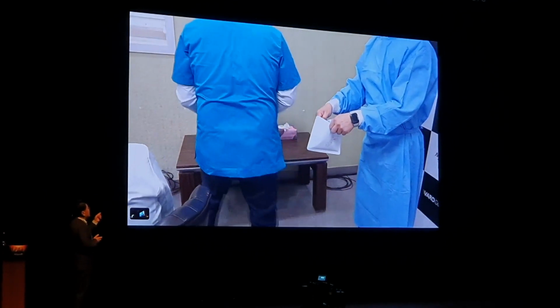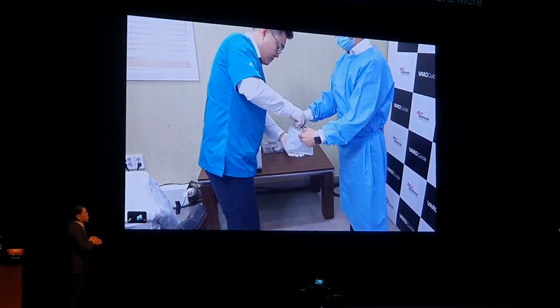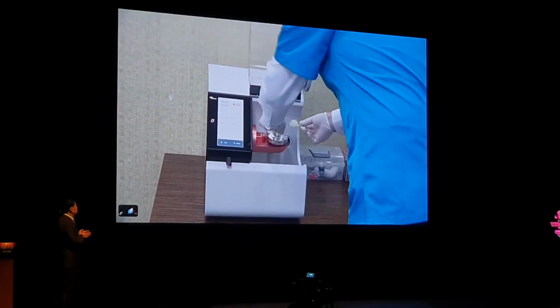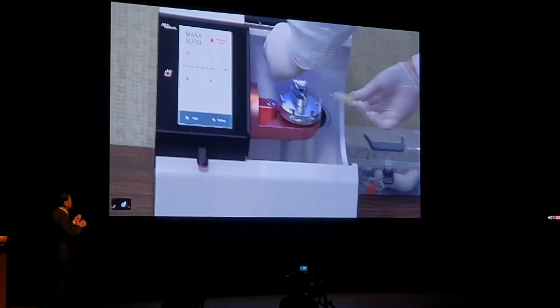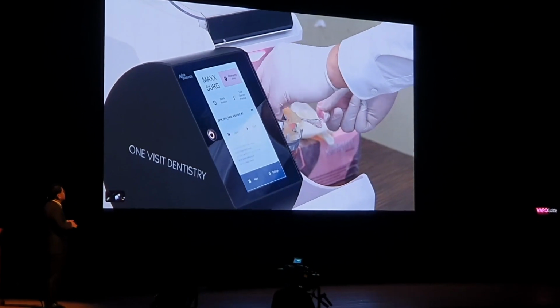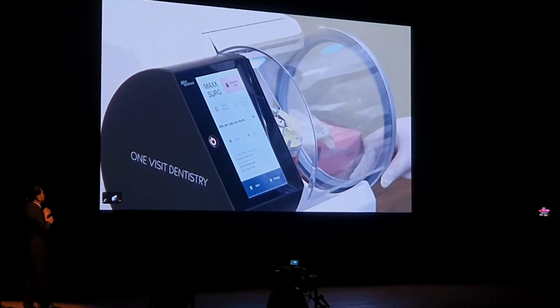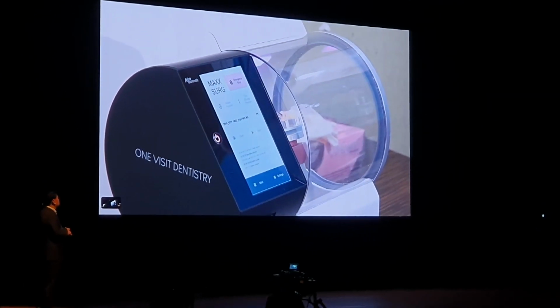So we now see the sterilized pre-guide setting on the milling machine. Open the cover of the milling machine and fix the 2 points index in the pallet's side and stabilize, screw tighten, then close the milling machine cover. Then open the NC file, and once the file is opened, press the start button. Very easy to do, right?